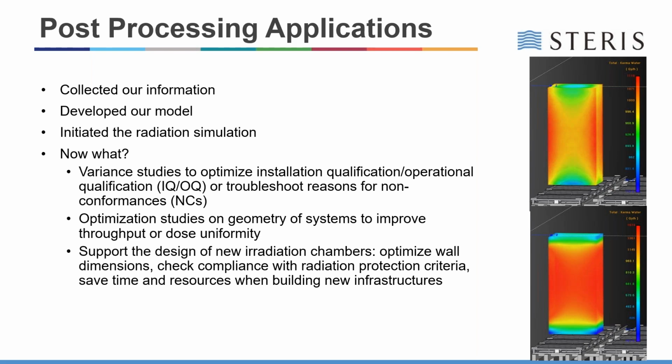With the variation that can be performed with simulation, iteratively going between many different examples of different scanning widths, we're able to see the impact that this would have on product dose distribution. This is extremely powerful, especially considering the impact that such changes to the system, to the source, have on the dose uniformity.